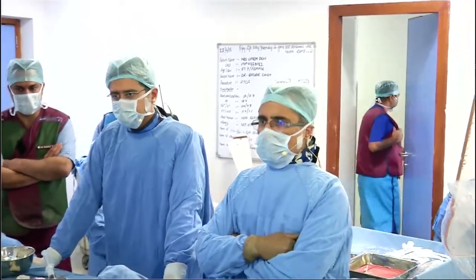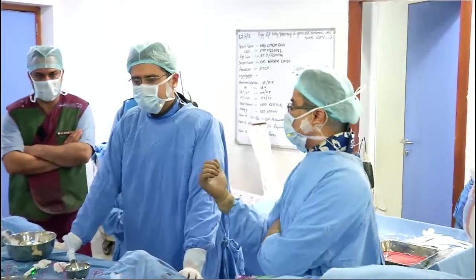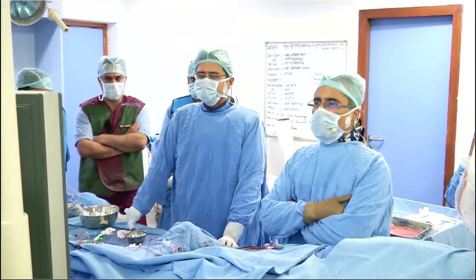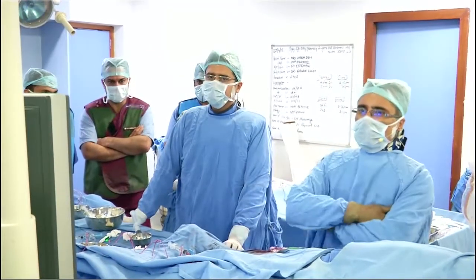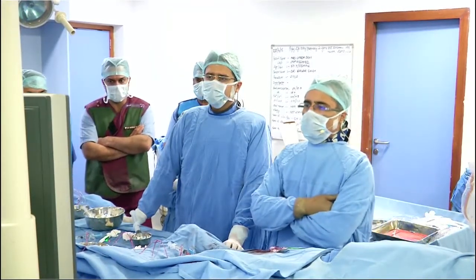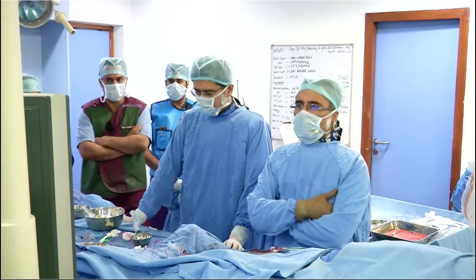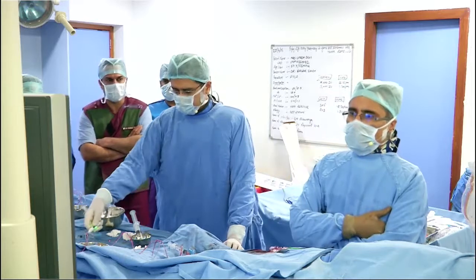And thanks, Dr. Himanshu, Dr. Dhirendra is here with us. So the full team was geared up, and then there was a sudden switch that we had to take this patient, because once we were not entering into a retrograde channel, there was no point, because there were no discussion points.